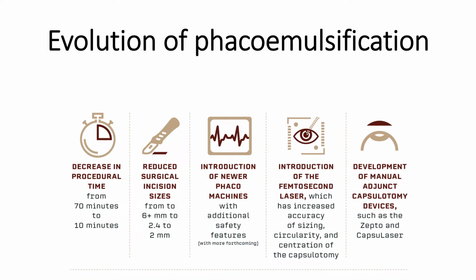For those people who are unable to perform a good rhexis, we now have capsulotomy devices which can perform a good rhexis. But there's an irony with these devices that these tools are more useful for those surgeons who cannot do a very consistent and regular capsulorhexis. But unfortunately, these are those surgeons who are less experienced and at the same time they have less capital to invest, so they may not be affluent enough to afford these new tools.